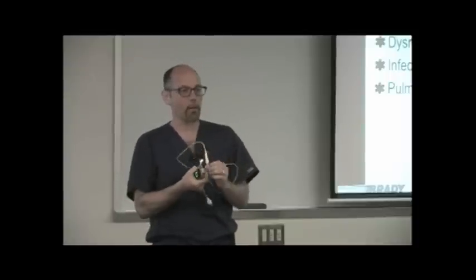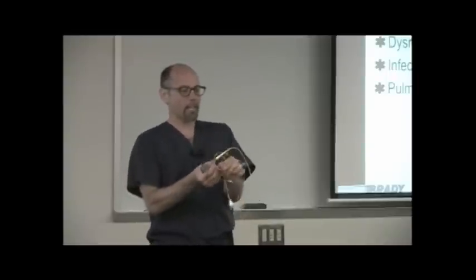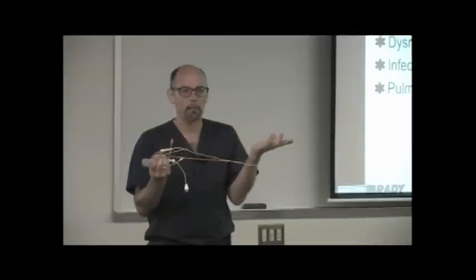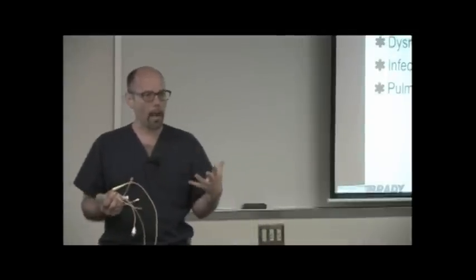If it goes in too deep, it can puncture the pulmonary artery. If it slips back into the right ventricle, this sharp tip is going to be bouncing around on the inside of the right ventricle. What do you think could happen? Arrhythmias, perforation. So your goal in taking care of a patient with a pulmonary artery catheter in transport is mostly just knowing where the tip of that catheter is, and knowing what the patient's normals are and where you would start to get excited about doing something before the patient actually got hypotensive.